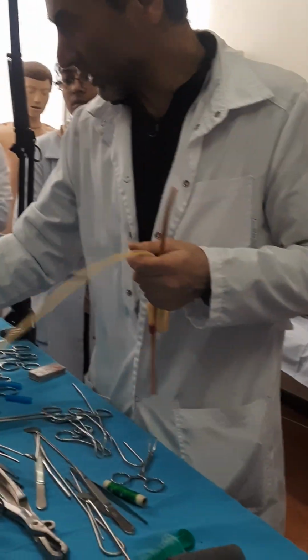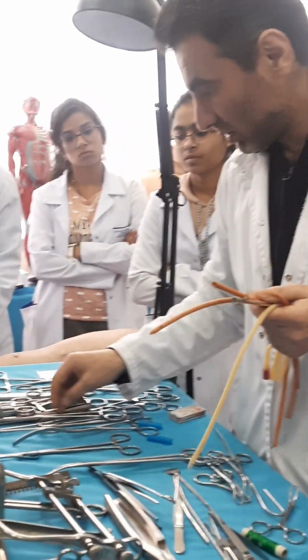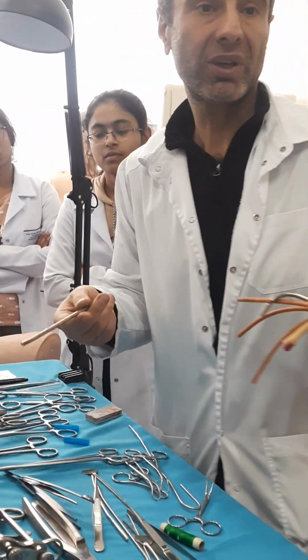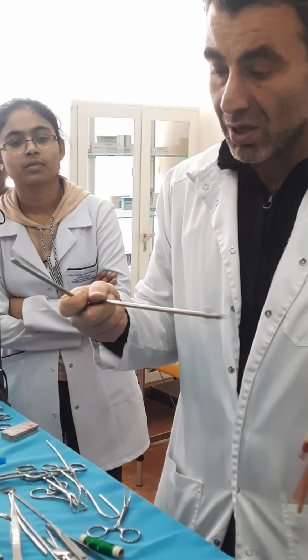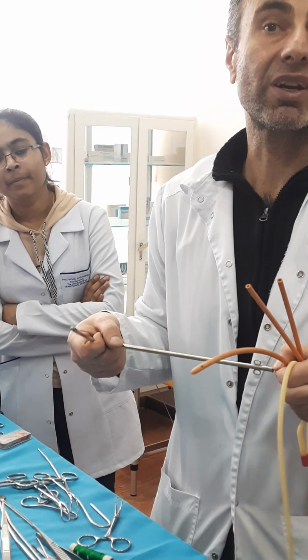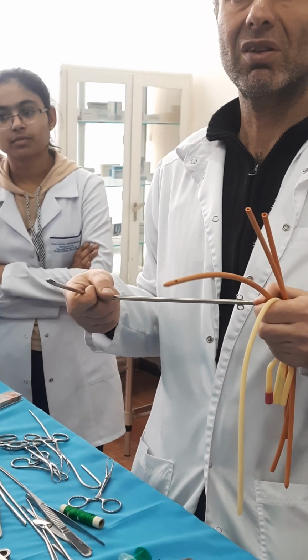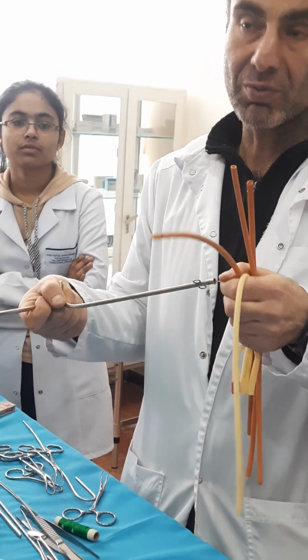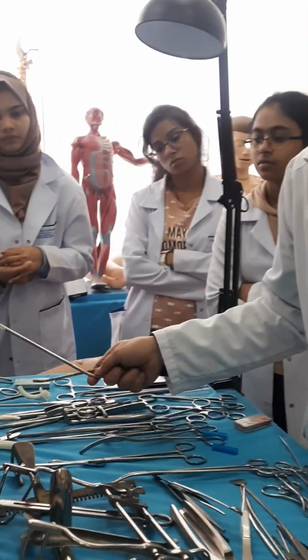Catheters, also urinary catheters. Rubber elastic, metallic strong. A metallic catheter is generally used for one case: if there is an obstruction and an elastic catheter is impossible to insert. It also has a mandrin, which protects the inner surface. But don't use this metallic catheter.